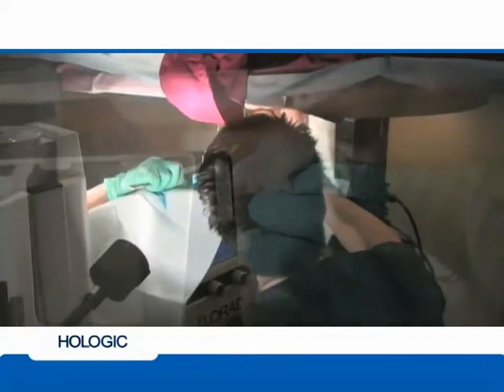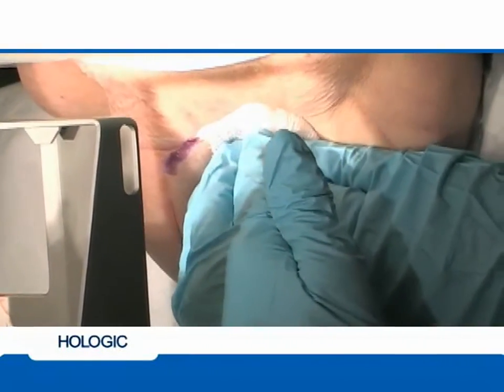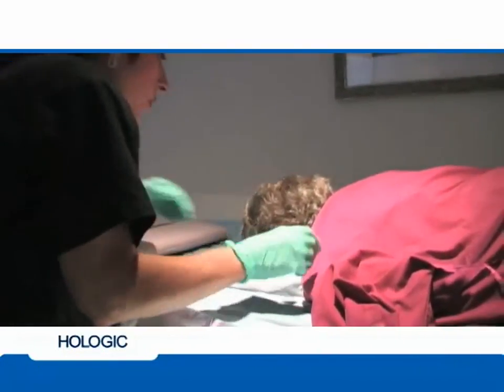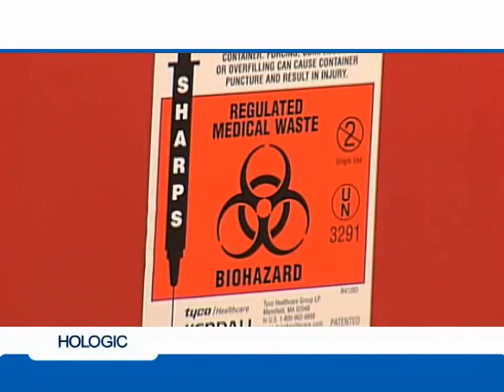Immediately apply pressure to the biopsy site. When pressure is no longer needed, apply a steri-strip or other bandage to the biopsy site. Help the patient to an upright position and discuss post-biopsy care. Appropriately dispose of all used product, such as device, marker, deployment device, canister, etc.